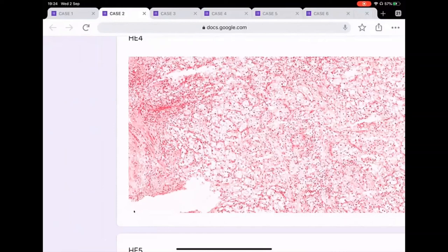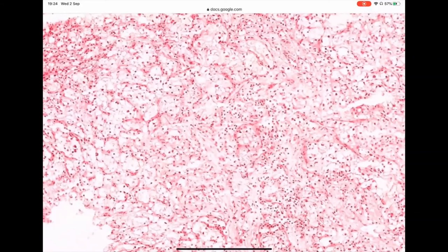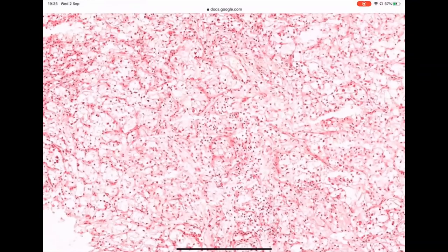It is like some spindle cell tumor, which I always tell my registrar: if you think your tumor is a sarcoma, but you see the entire tumor inside your slide, then ask yourself again, why do you want to diagnose something that small as malignant? Okay, but what I mean by this is that it's important to understand the adrenal rest is an encapsulated lesion. When you see it, it usually fits onto the slide, and it will have the zonation.